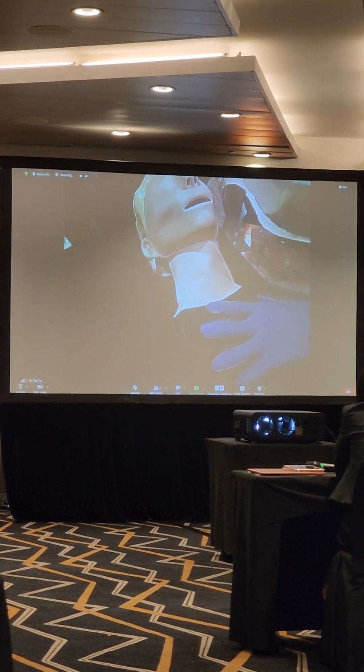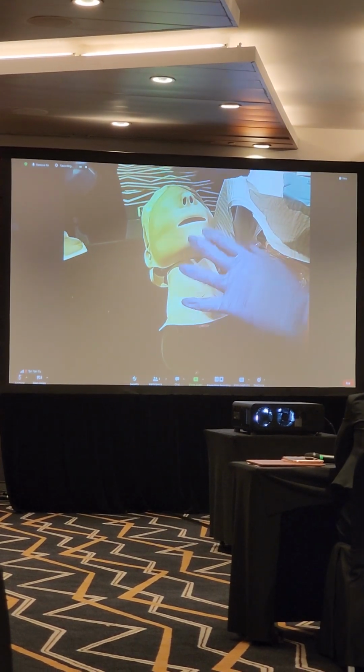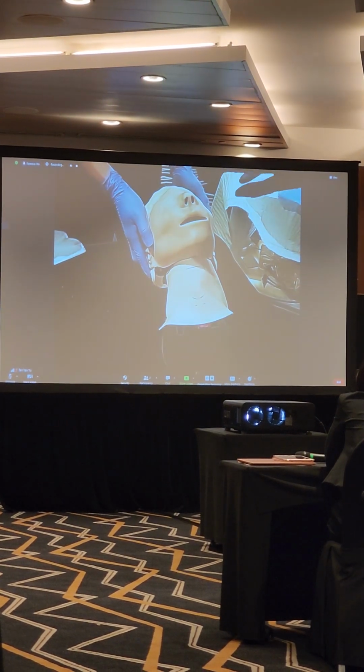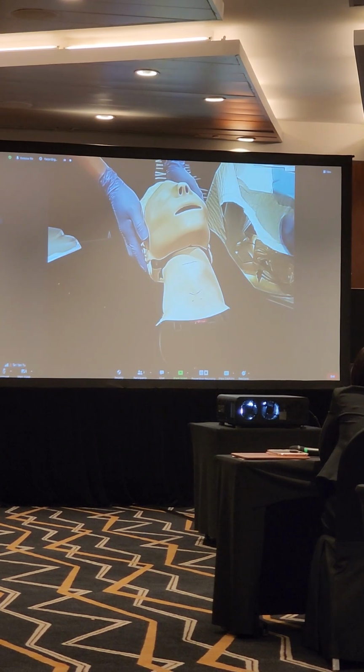So looking at this mannequin over here, everybody can see very clearly. Ideally, we would also incorporate into this training, for example, shifting the patient from a sniffing morning air position to an extended neck position if there's no evidence of any cervical trauma.